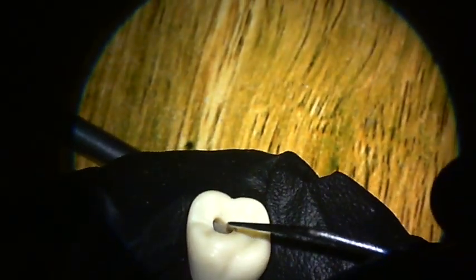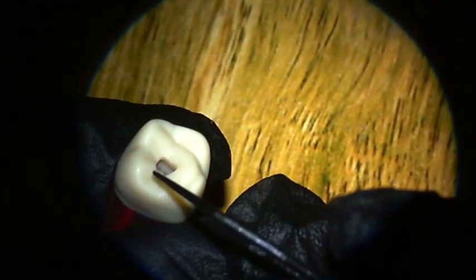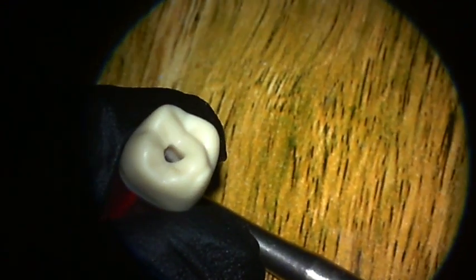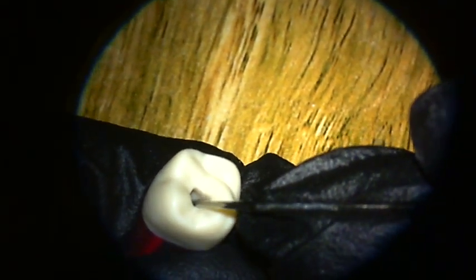And also the internal buccal wall has a smooth, flat wall, but the distal wall has some kind of a step in it, dividing the area of the chamber from the area above the chamber or above the roof, which is part of the normal anatomy and it's not a roof, so that should remain. How do you know that? There should be no catch when you're passing the probe in between those two compartments.